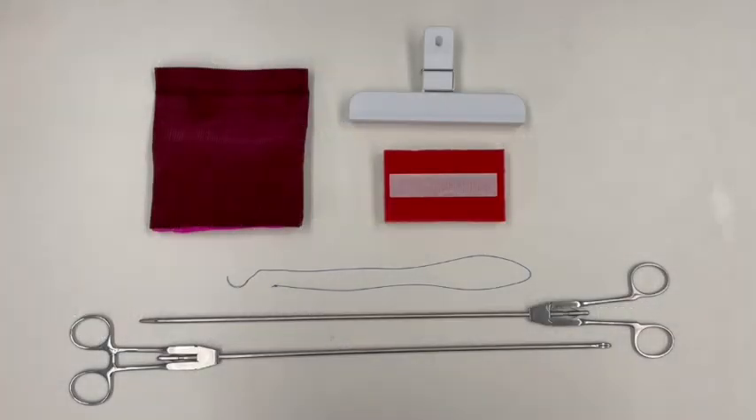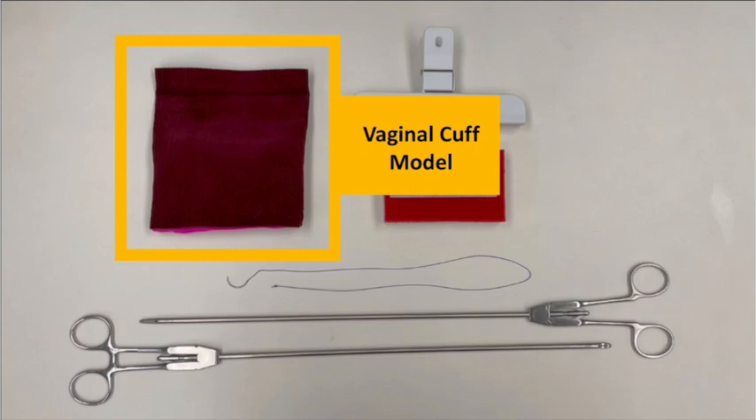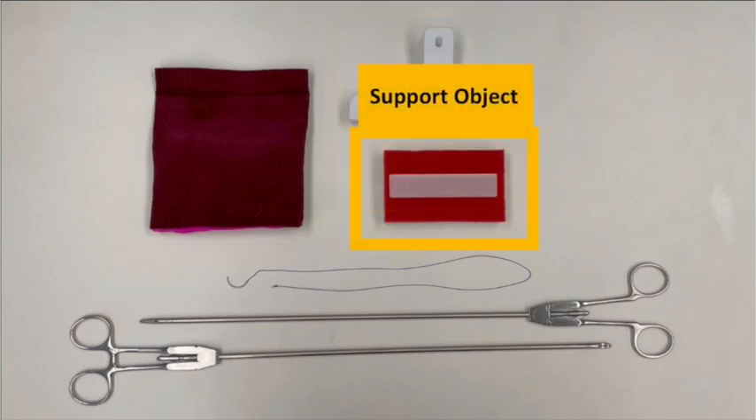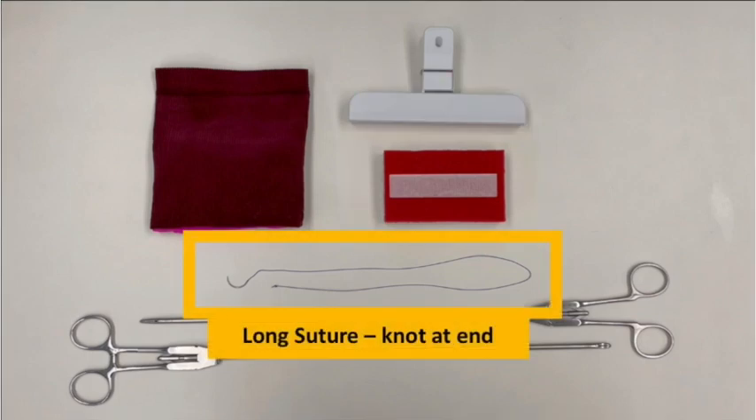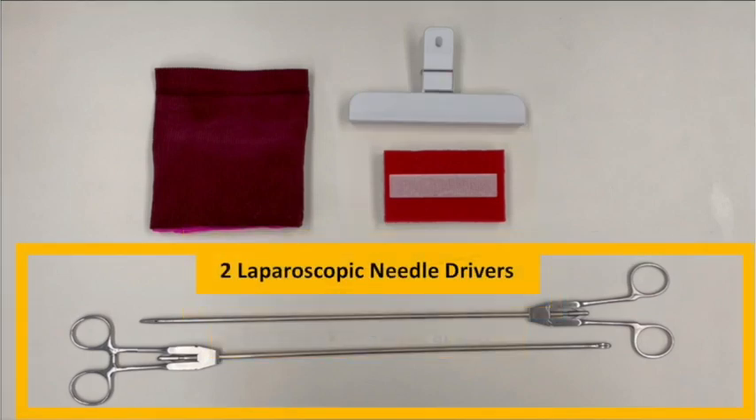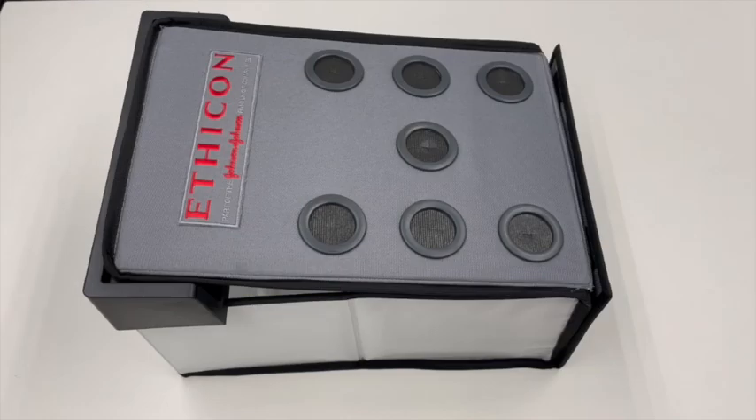To perform this task, you will need the following items: a vaginal cuff model, one to two clips, a support object, a long suture with a knot at the end, two laparoscopic needle drivers, and a laparoscopic box trainer.